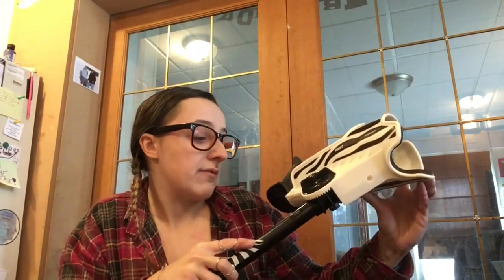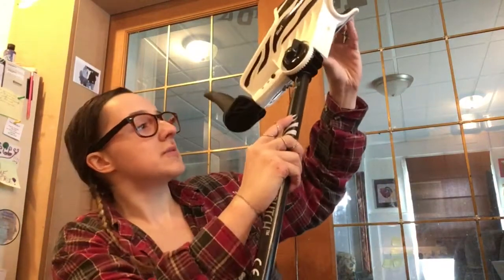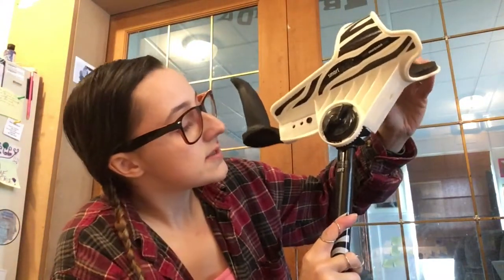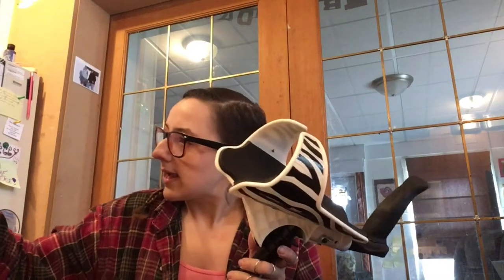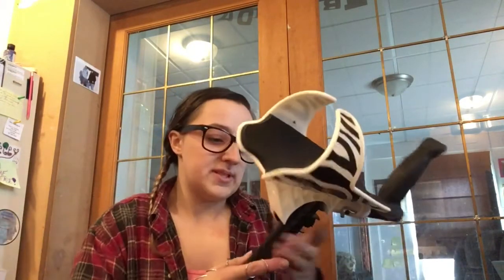Anyway, this part here turns, and it has 4 settings and anything in between, really. There's this one here, and then this one, and then this one. It goes as far as about here, and then it says you can't turn it anymore. I'm finding that I currently like it between a 4 and a 6, because it goes 2, 4, 6, 8. But I'm still playing with it right now. And then this portion here, this is your wing nut, and this controls how long this part goes. I haven't played with that just yet, but I'd like to in a minute. I'd like to see if I need to get it adjusted to my size better.